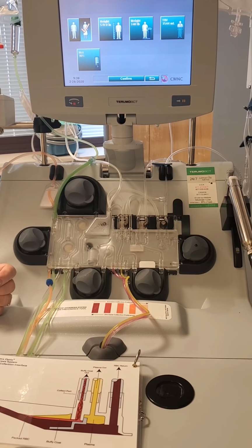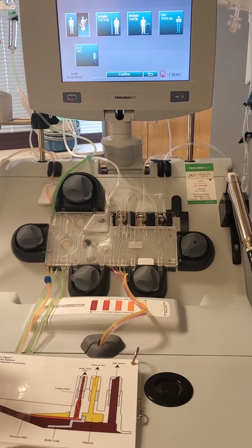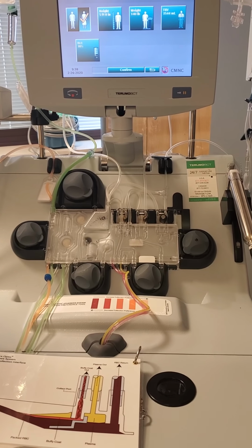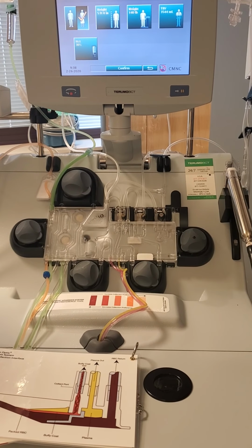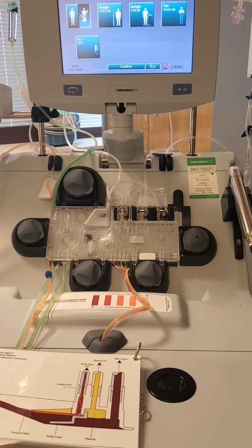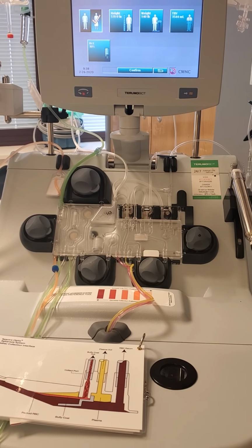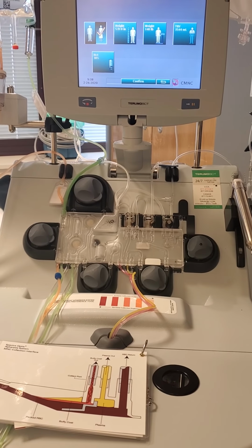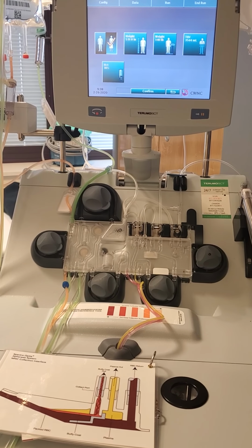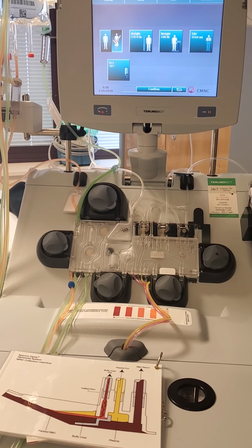Two opposite problems. So as an experienced operator, if you're not real clear on spillover versus this one, make sure you're reading that troubleshooting so you don't move the crit in the wrong direction and make the problem worse. But with the update, it would tell you what to do. Absolutely. It would direct you, so you don't have to guess. Remember, one of the things I might have said yesterday is use the Nike logo. Just do it. Even if you're not sure why you're doing it, the understanding will come later.